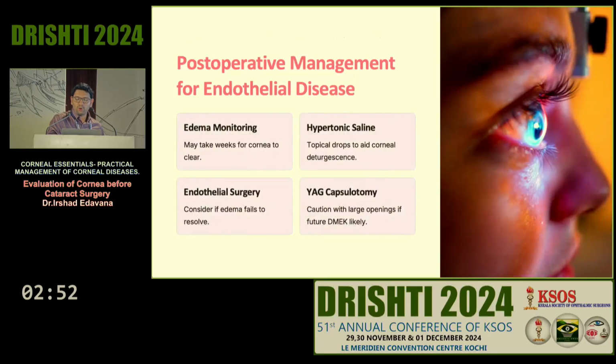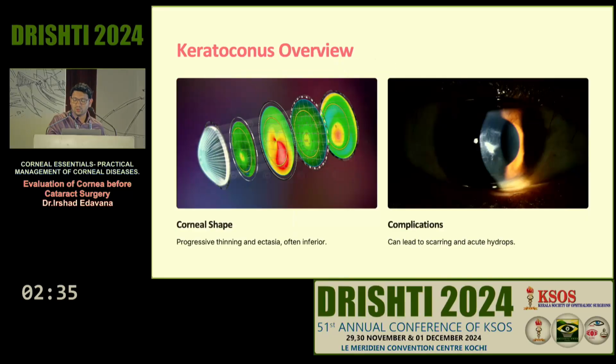Postoperatively, monitor the edema with pachymetry. You can use hypertonic saline. If the edema is not resolving, or is increasing, we can plan for endothelial surgery. And try not to do a YAG capsulotomy, because a large capsulotomy may also cause some difficulty during the endothelial surgery.